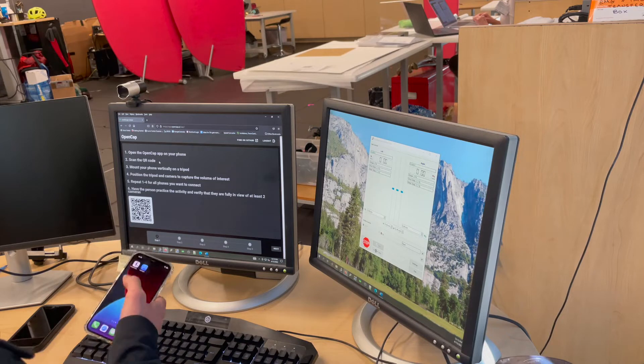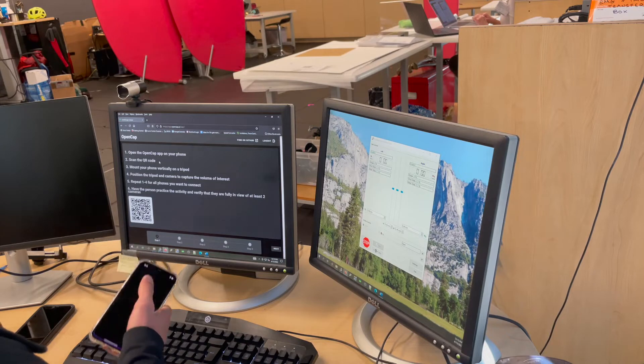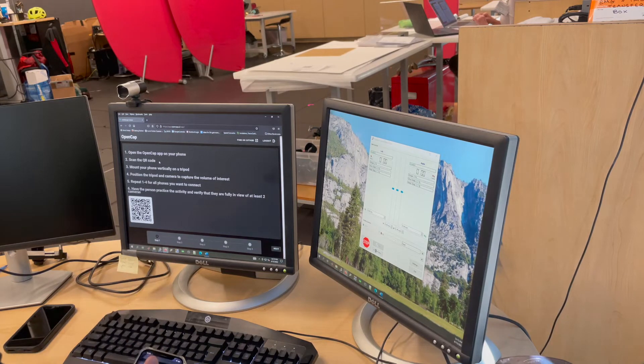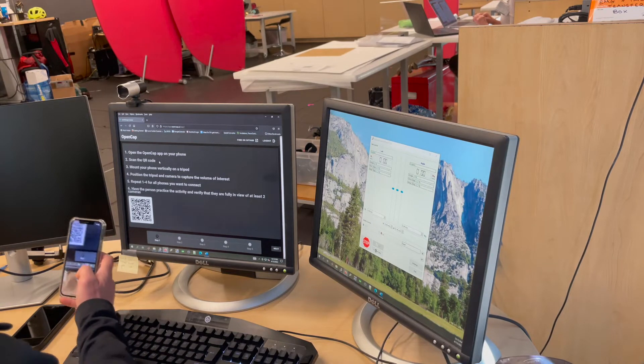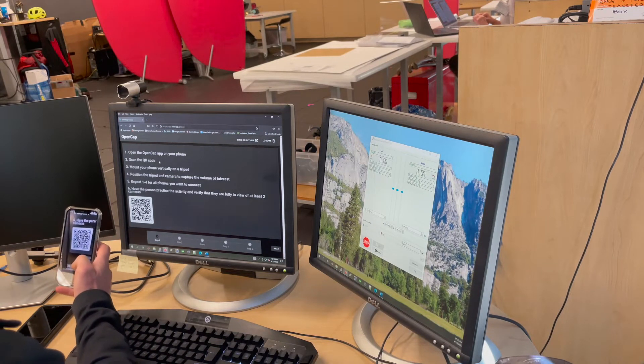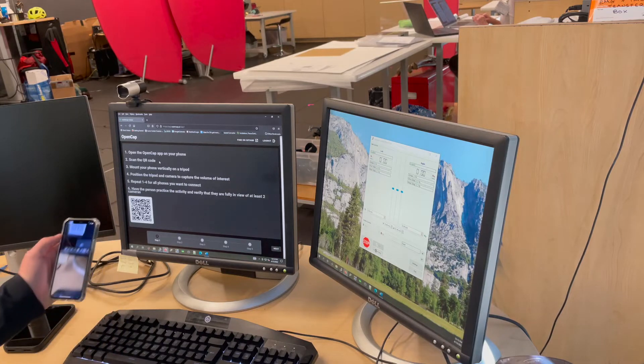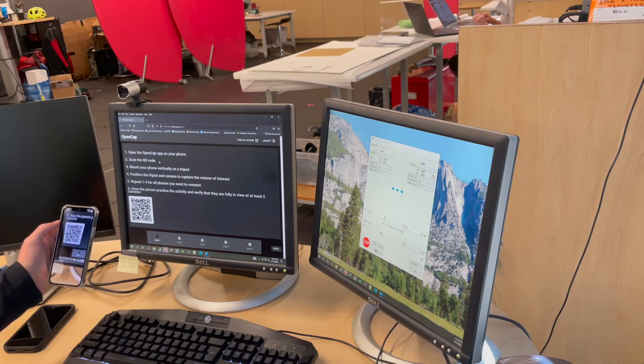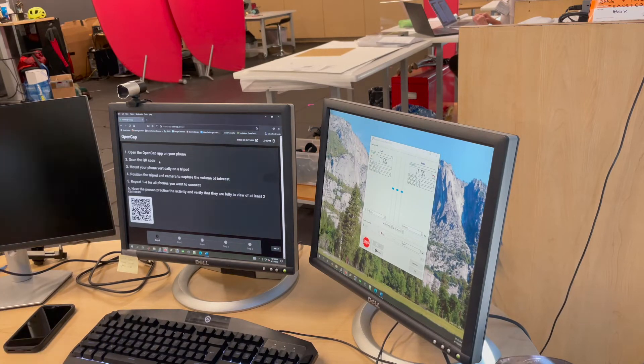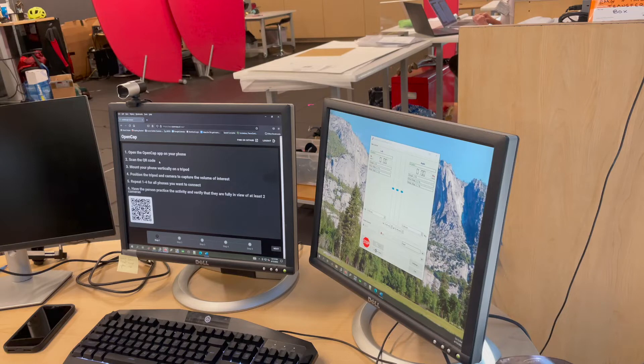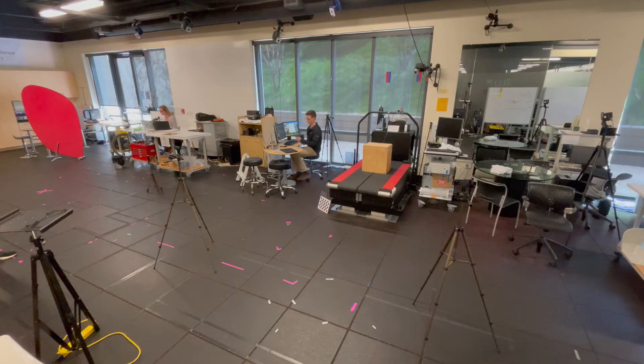Open the OpenCap application on your iOS devices and when you see the camera viewer, scan the QR code. You should see the image flash on the screen or your iOS device will vibrate to tell you that it has been paired to the session.